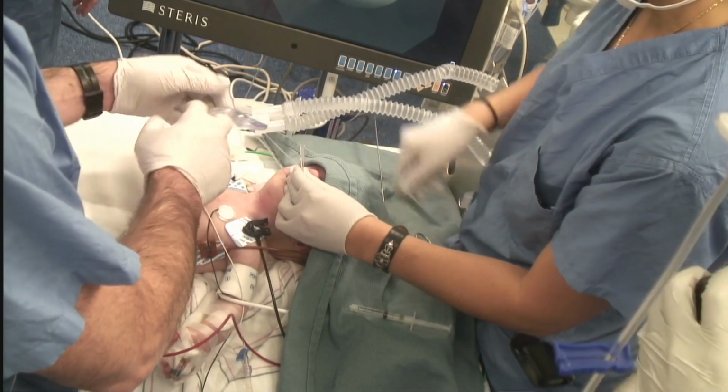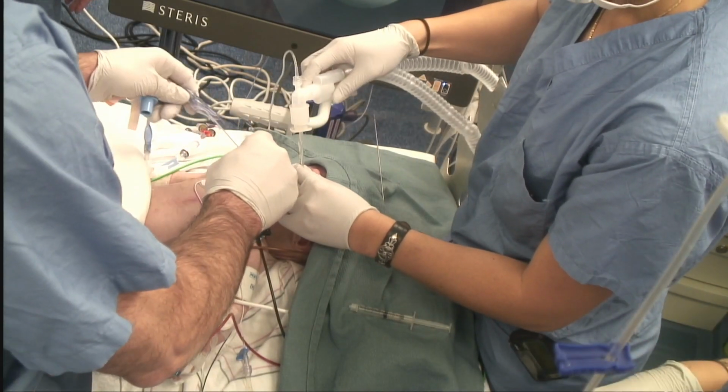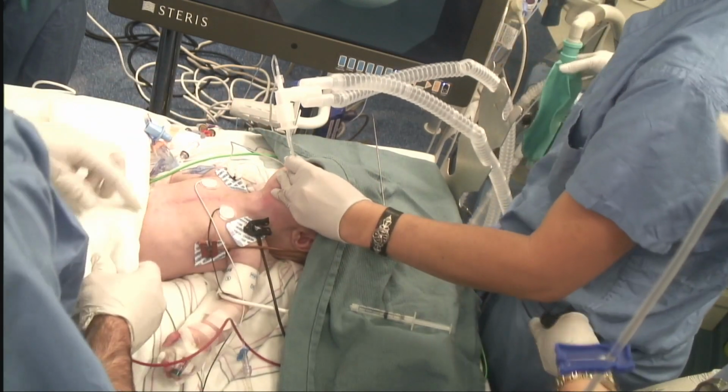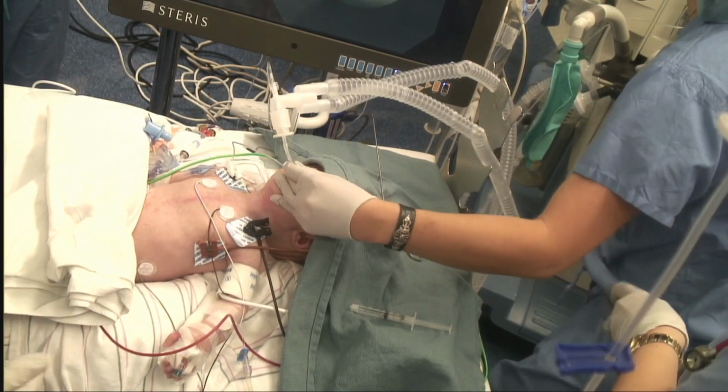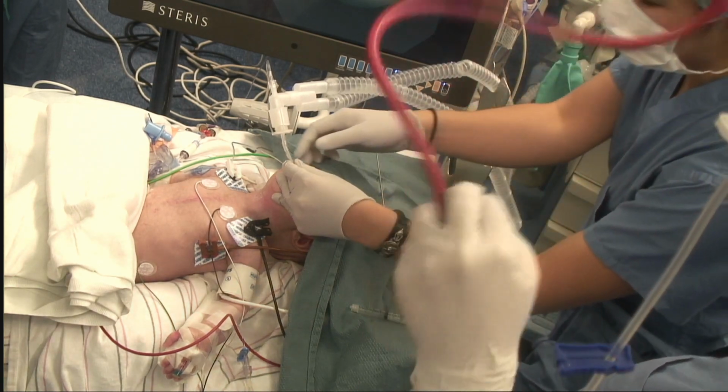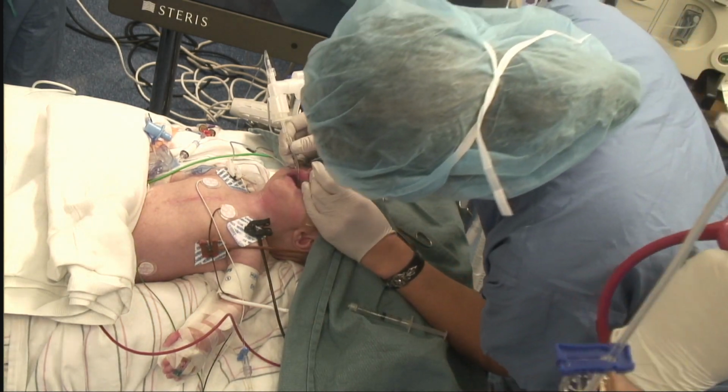Adequate lubrication is essential for both the tracheal tube and the pilot balloon. The pilot balloon must be well lubricated before pulling it through the airway conduit of the device. If difficulty is encountered while trying to pull the pilot balloon, it is better to push the pilot balloon through using whatever stabilizer was employed for the tracheal tube than pulling on the pilot cuff line with force, as the latter will more likely separate the pilot balloon from the pilot cuff line.